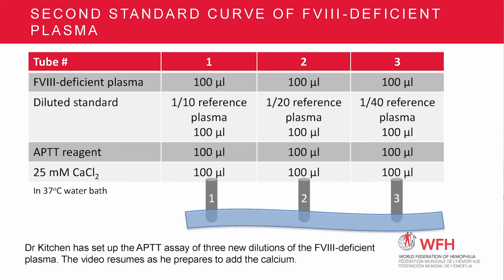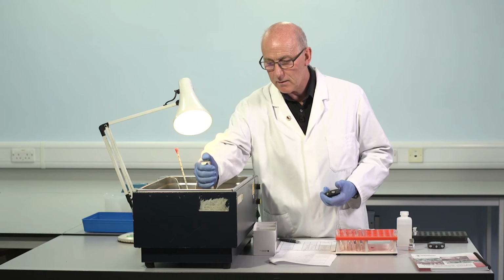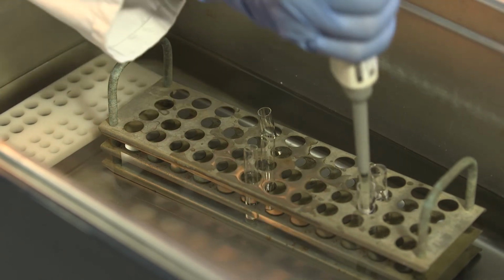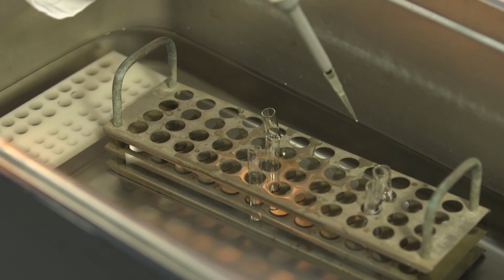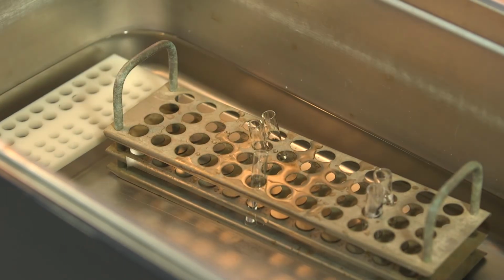Just now, I'm running a new calibration, a second standard curve. It's the same reference plasma, 3 new dilutions, 1 in 10, 1 in 20, 1 in 40. Prepared these dilutions afresh with new tubes, a new buffer. And I'm running this at the end of all the patients. So as we get to 3 minutes, calcium to the first, 1 in 10. 15 seconds later, 1 in 20, and mix in the third tube.